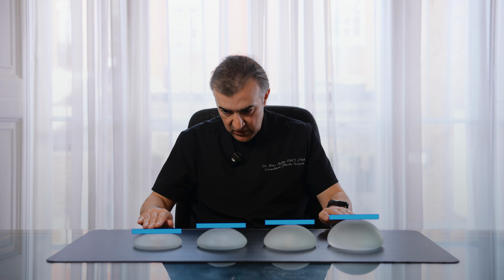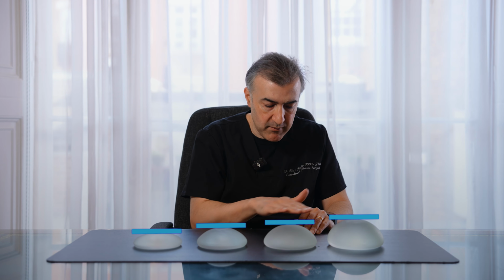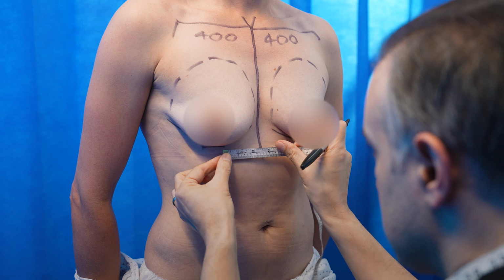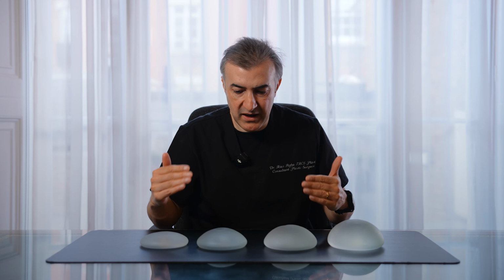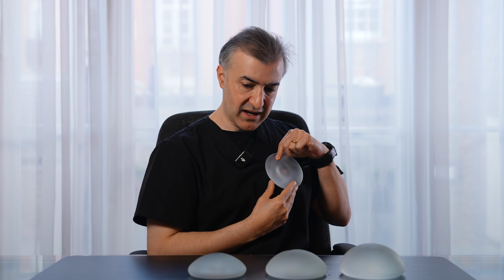If you have a look at these breast implants, you can see just how much they're coming off the desk here. And as we're going along, they're coming up more and more. And the actual diameter of them is pretty similar. So you can get an implant which has exactly, for example, 12 centimeters across, and they can all be 12 centimeters across, but they've got different projections. And that means they've got different amounts of volume, or cc's is how we'd measure it. Now, when you actually place them on, you'll see that the projection is just how much they're coming out of the chest forwards. So as you go up, you will have more and more projection.